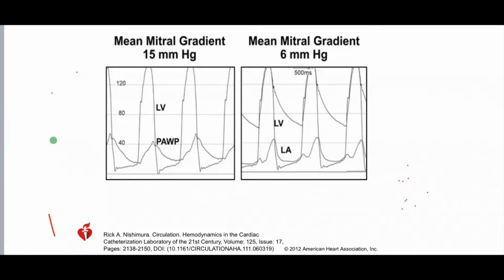If you look at the wedge, the left tracing, there is a high gradient of 15.